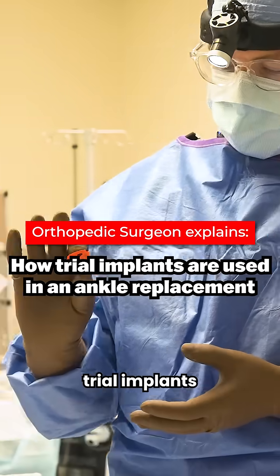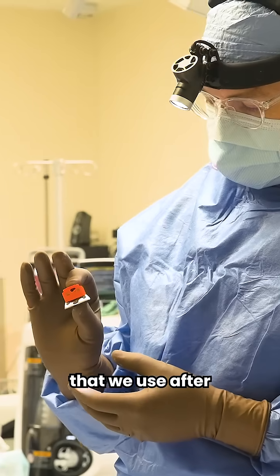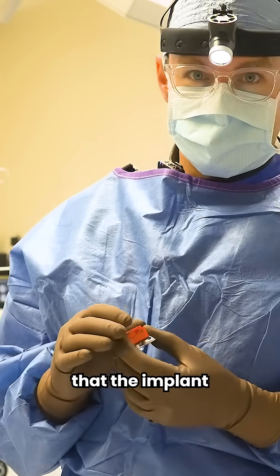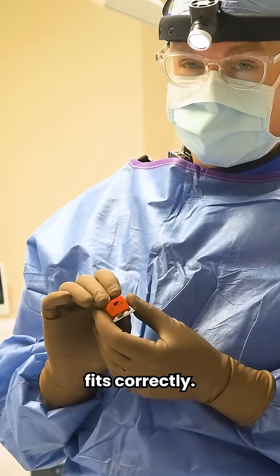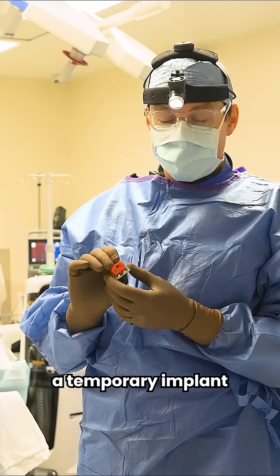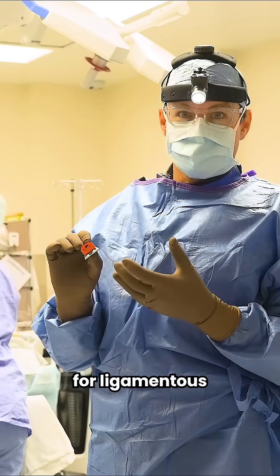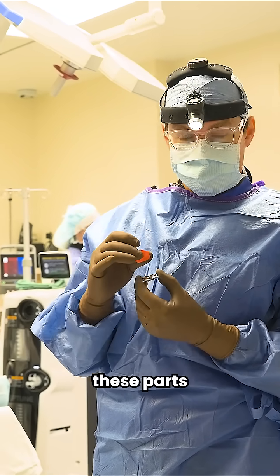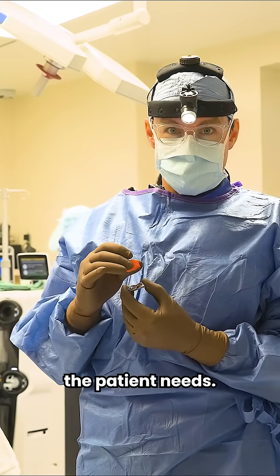These are trial implants that we use after all the bone cutting is done. We make sure that the implant we're going to put in fits correctly. It also allows us to put a temporary implant inside the patient to check for ligamentous stability and to change out these parts to customize exactly what the patient needs.